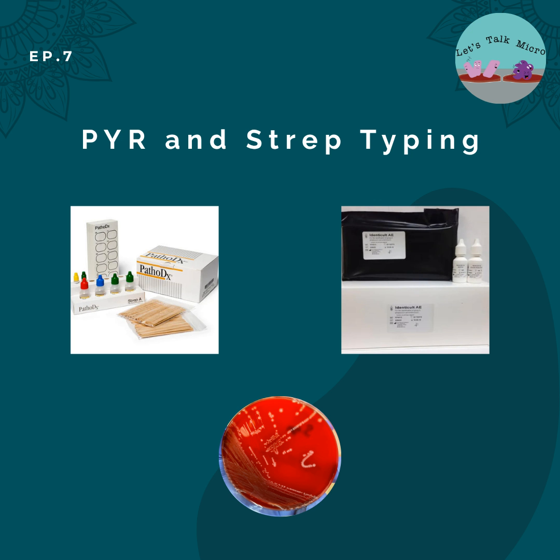So bottom line, you're at the urine bench, and maybe you have 2 or 3 colonies. You don't need to do susceptibilities unless the patient is allergic to penicillin. So with that 1 or 2 colonies, you go ahead and do your extraction, you get your positive result for group B, and then you're done. Report your colony count, and that's it. You don't have to subculture it, you don't have to wait for the next day. That's why I like the extraction procedure. You don't need that much to get that beautiful positive reaction.